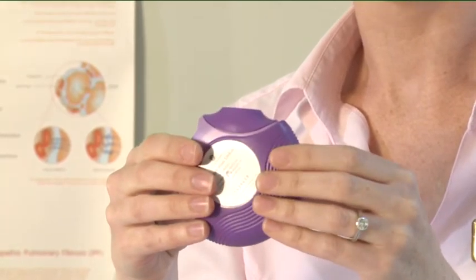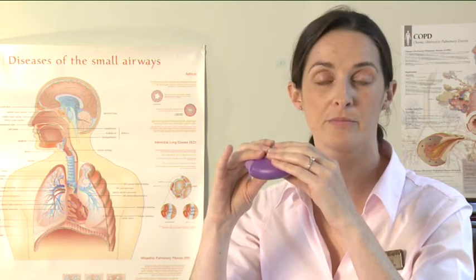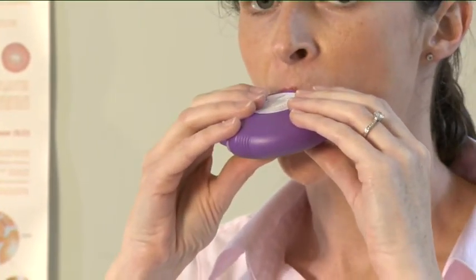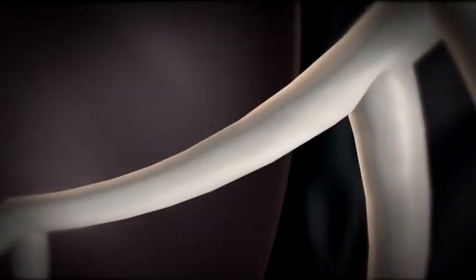Hold the discus away from your mouth. Breathe out for as far as is comfortable. Do not breathe into your discus. Put the mouthpiece to your lips. Breathe in steadily and deeply through the discus, not through your nose.